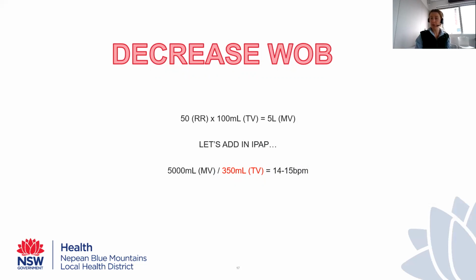All right, so let's put them on some non-invasive ventilation. Let's put them on BiPAP, add in an inspiratory pressure where suddenly we're helping them take a bigger tidal volume because we're making it easier for them to breathe in. So I'm going to switch that conversion around.